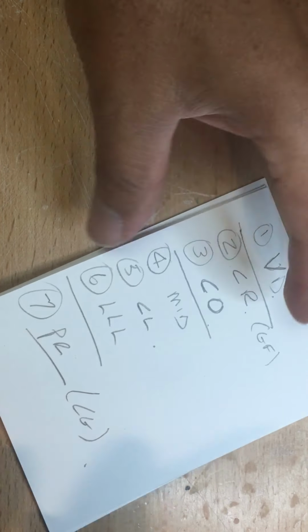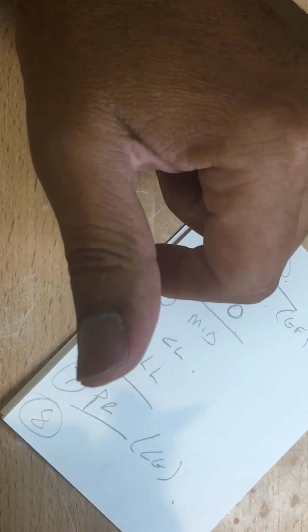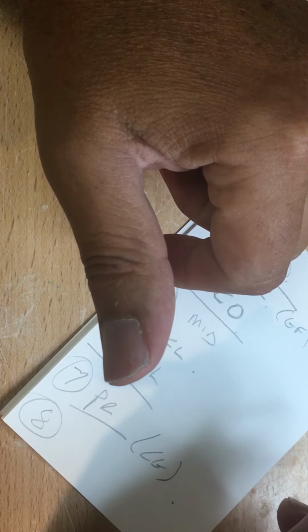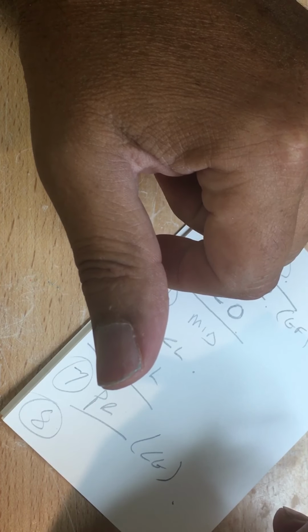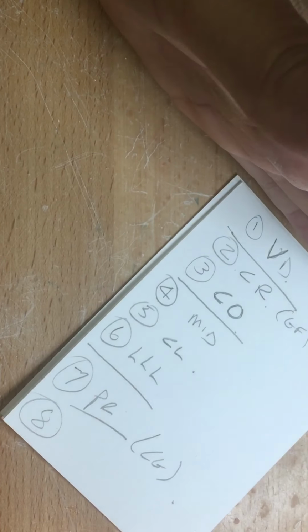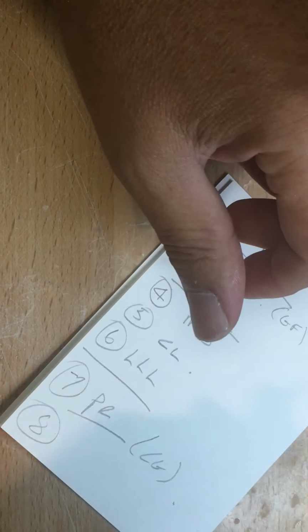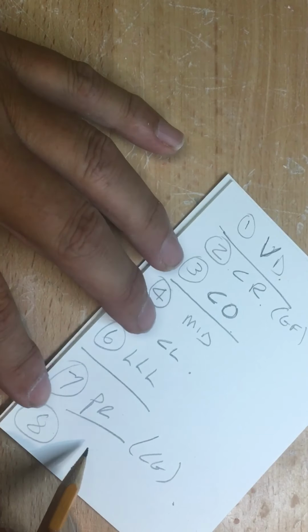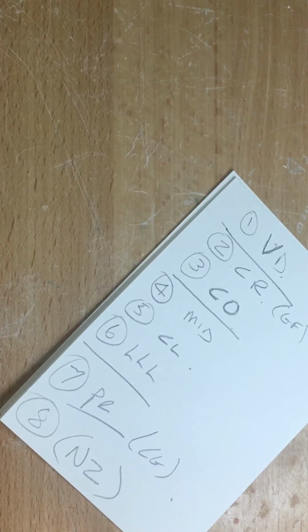One other thing that is really underestimated is the, we're going to call it the buccal corridor, or the width, or the extension, or the lip support, or the cheek support in the posterior section. Now there is a neutral zone, so we're just going to call it neutral zone estimation.